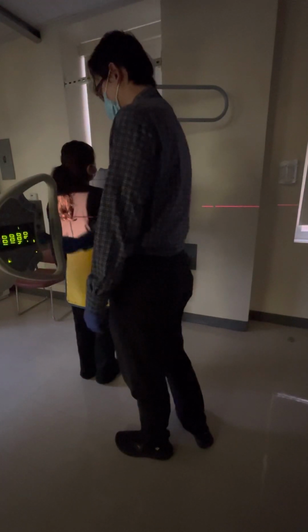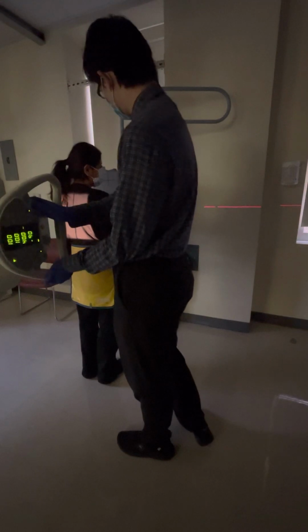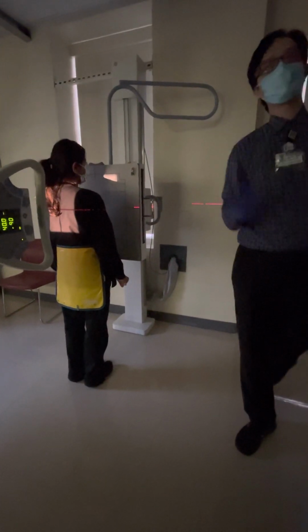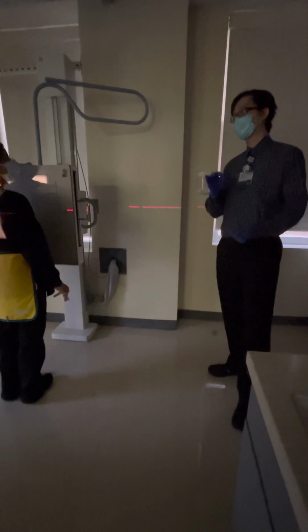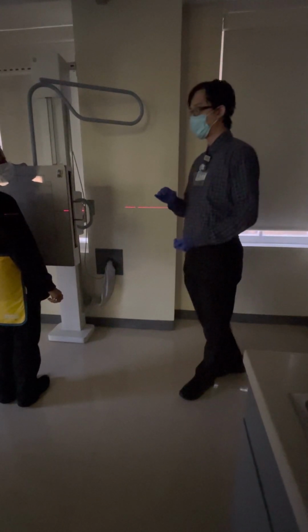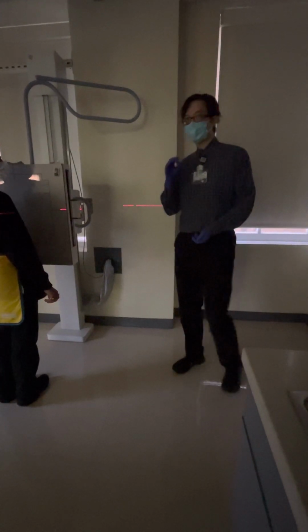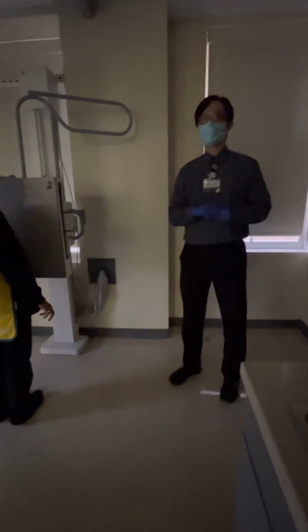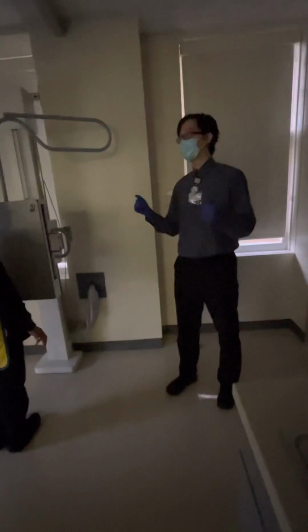So doing both like LPO, RPO. Correct, we're going to do both. That's right. And so, one more thing about obliques. You can do obliques unilateral or bilateral. And all this means is, are you catching only the part of the ribs you're interested in that are supposed to be demonstrated, or are you going to demonstrate the entire thorax?